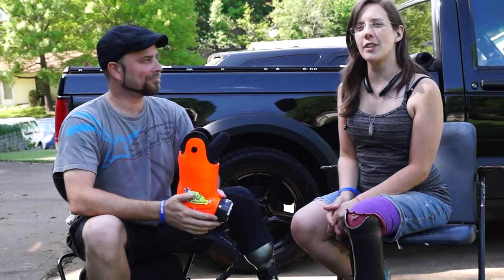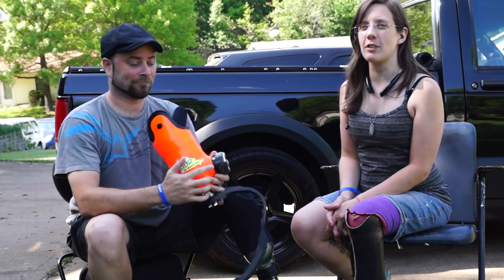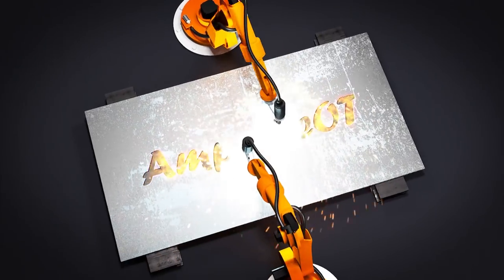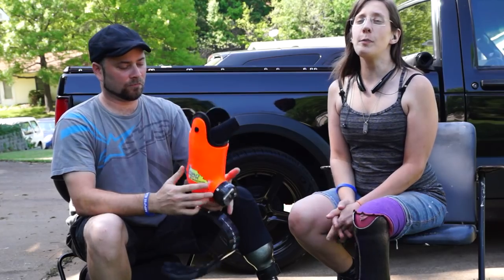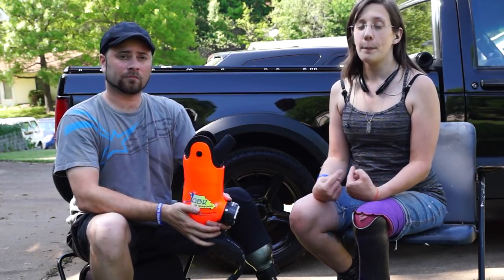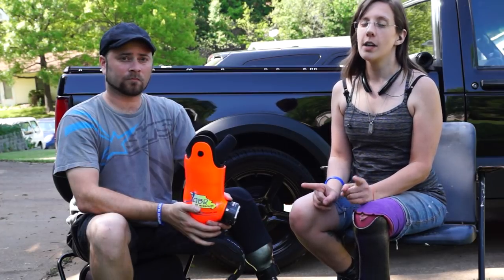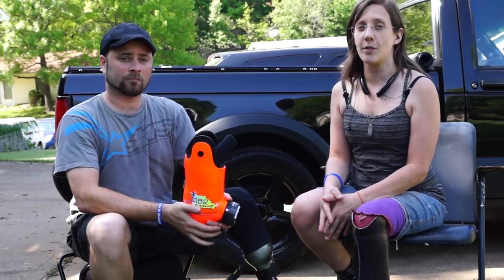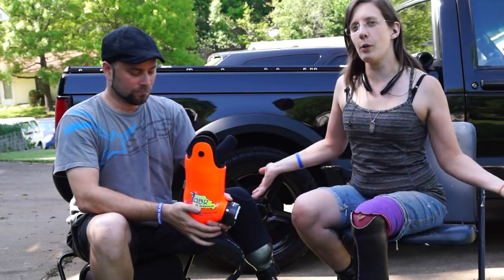Hi everybody, this is Kristina, the Amputee OT. In this video, we are going to be talking about vacuum suspension for amputees. In a bunch of my previous videos, I've shown you the different types of suspension that I've had — pin lock, proximal lock, and suction — but I haven't shown you vacuum suspension. Today with me I have my friend Jared, who has a vacuum suspension system for his running leg and one of his walking legs, and we're going to show you how it works.